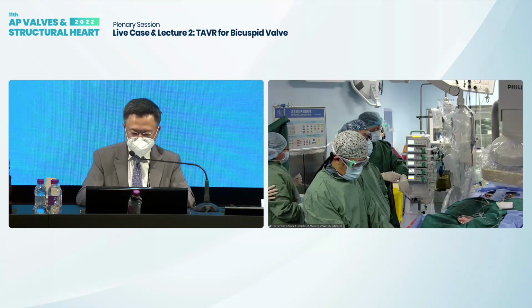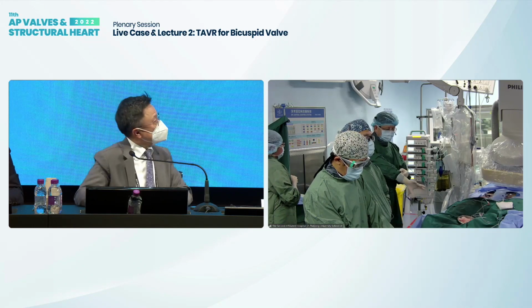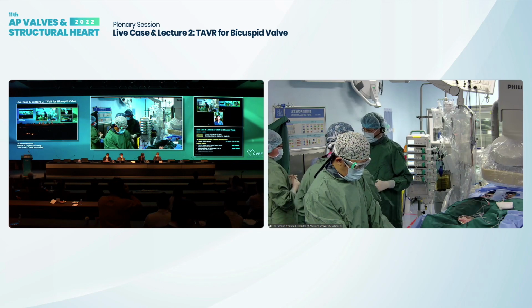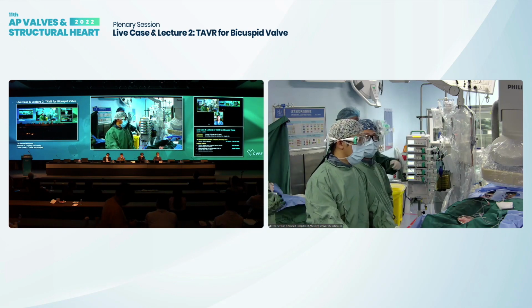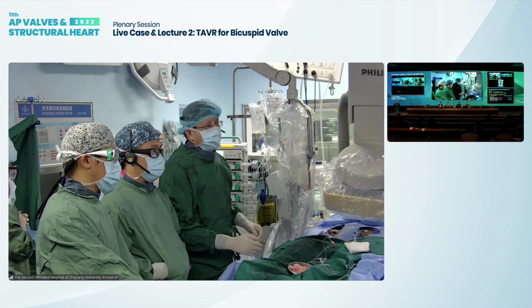Thank you, Professor Yang and Professor Hong and all of the faculty. I'm so honored to have you join our live demo session, transmitted from our side, the Second Affiliated Hospital, Zhejiang University School of Medicine. So first, please allow me to introduce my colleagues.